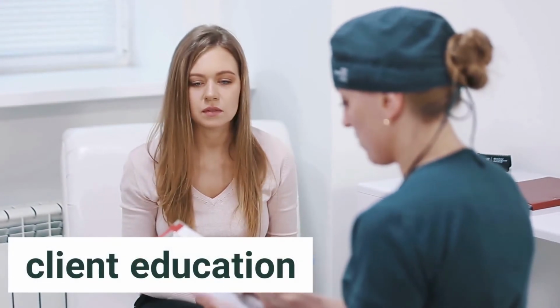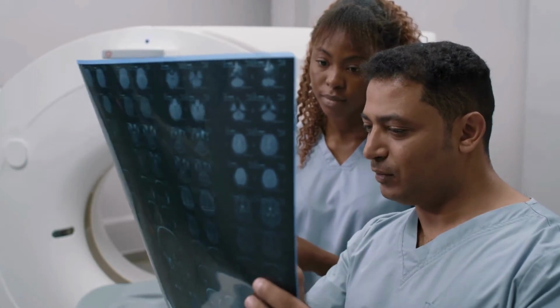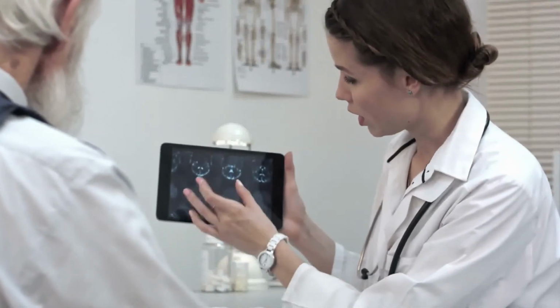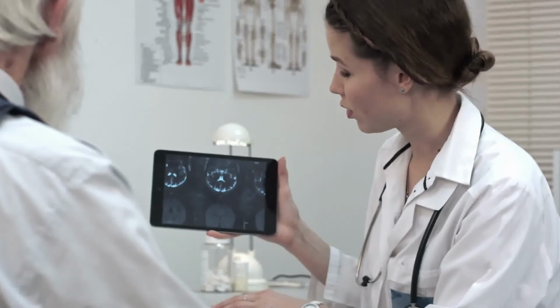Ensure that the client is not wearing any jewelry. A mild sedative for relaxation is occasionally administered prior to and during the procedure, and vital signs are continuously monitored during the procedure. Client education. The head will be immobilized during the procedure, and it is important to remain still. Void immediately prior to the procedure. Following dye injection, it is common to experience a metallic taste and feel a sensation of warmth behind the eyes and over the face, jaw, tongue, and lips.